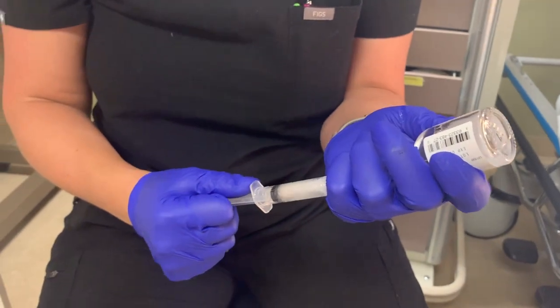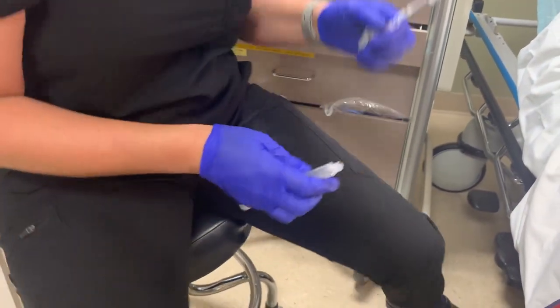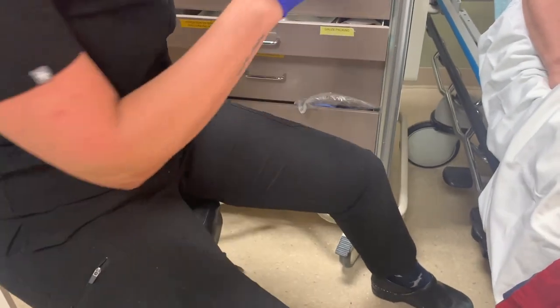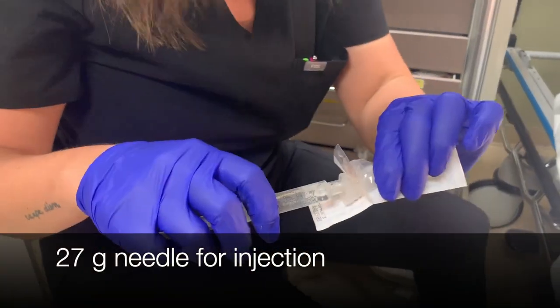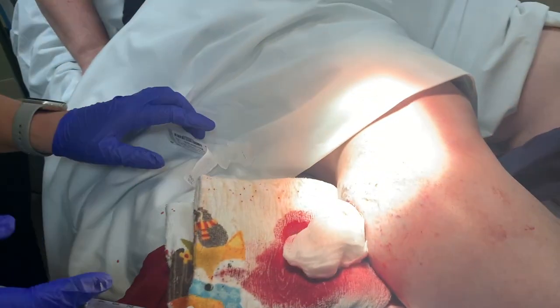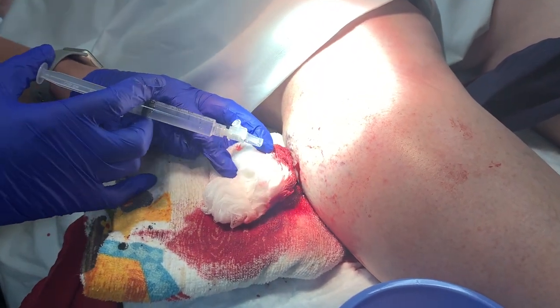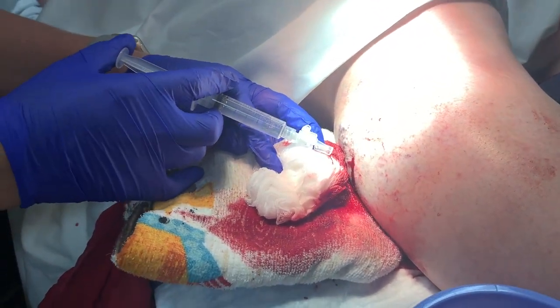So I'm drawing up some lidocaine with epinephrine, and we're going to use a 27-gauge needle to inject the area. Trying to stay out of the path of the vein here. You're going to feel a pinch and a burn. And it burns.